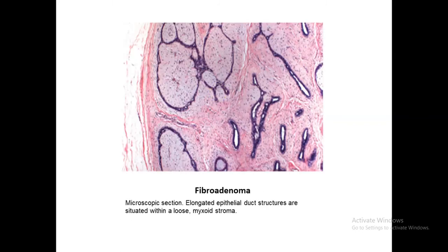Microscopically, fibroadenoma consists of two components: an epithelial component and a stromal component. The epithelial component shows ducts lined by epithelial and myoepithelial cells. There should be presence of myoepithelial cells, and this is the stroma, which is a myxoid type stroma.